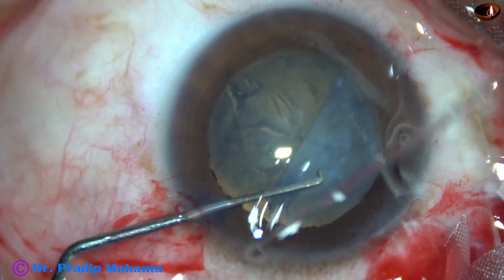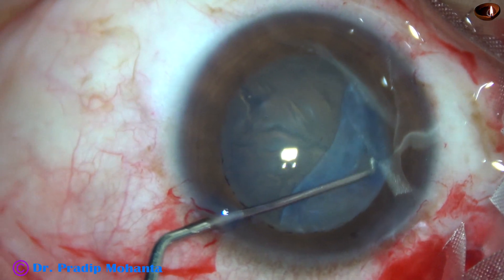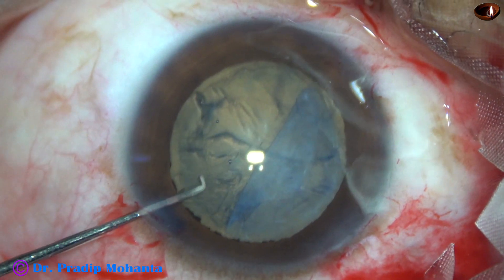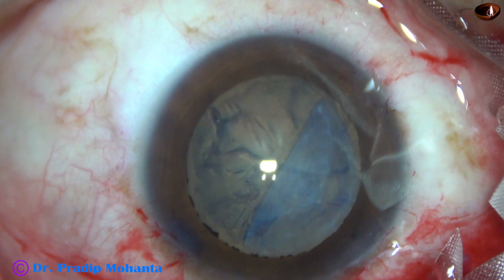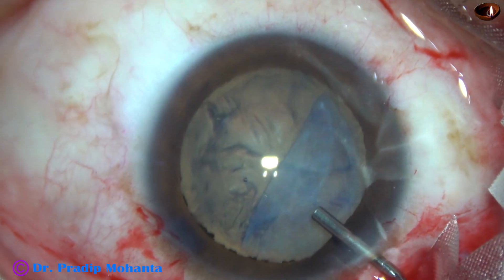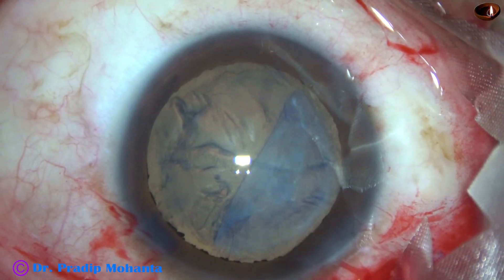But I'm not going to give up so easily unless the anterior capsule gets torn. So my plan is to try and try and try — injecting some more viscoelastic.